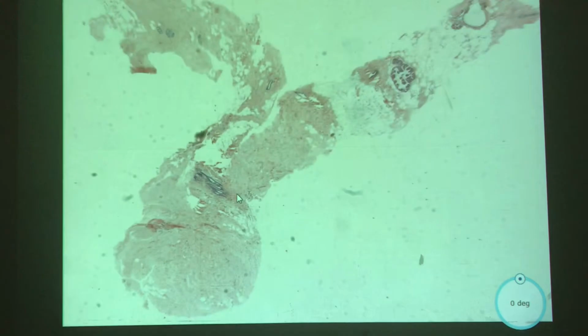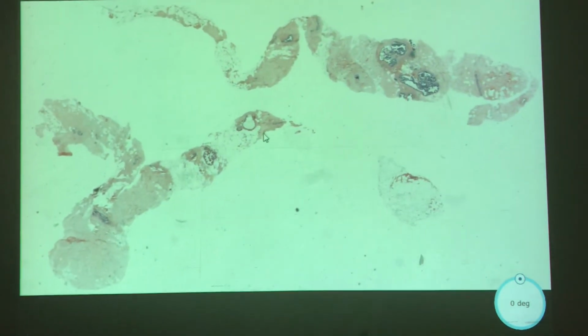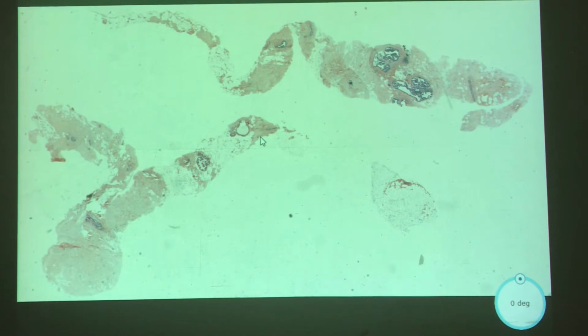This one, again, the staining's kind of dark, but it'll be bright red like you would see in GI. Because yes, Monday I have a video going up for adenoid cystic carcinoma that sometimes also has that Paneth cell-like eosinophilic granulations.